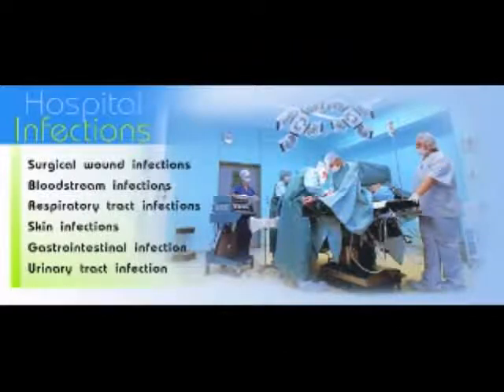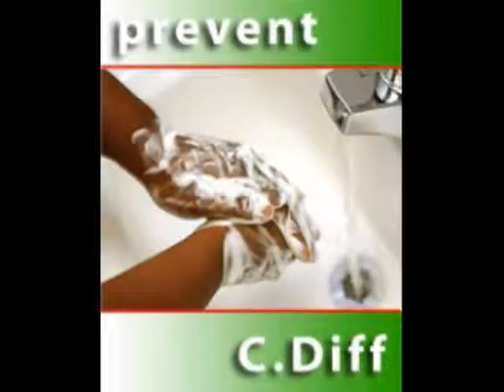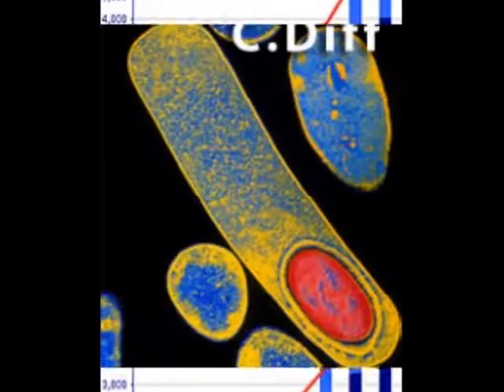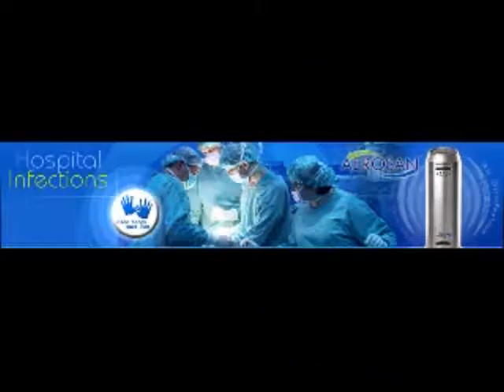So we decided that one of the ways to clean it is to use an automated bed equipment washer, which we've just installed. We're about to start now putting beds in where there's been somebody with an infection in that bed to deep clean the bed. And effectively, it's like pushing a car through a car wash. Yeah, it works either like a giant dishwasher or, because of the size of a bed, more like a car wash.